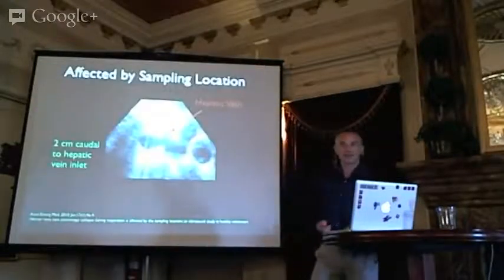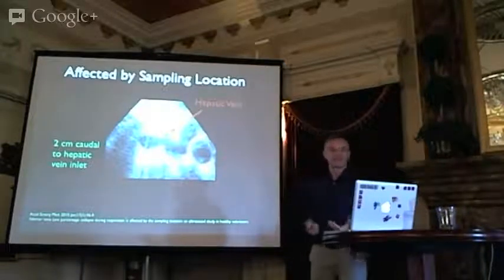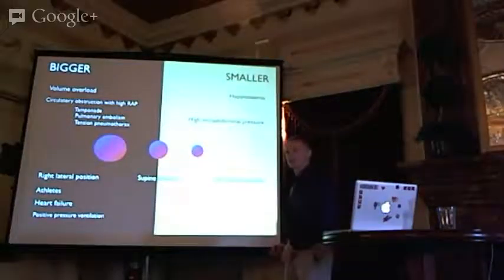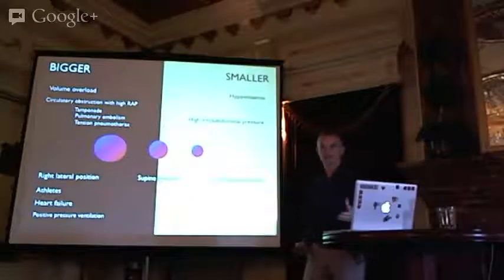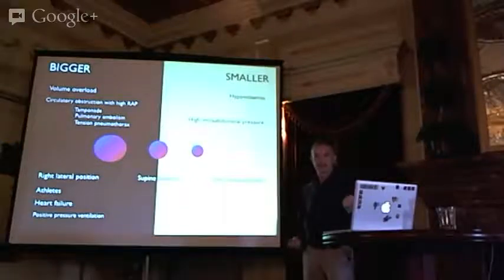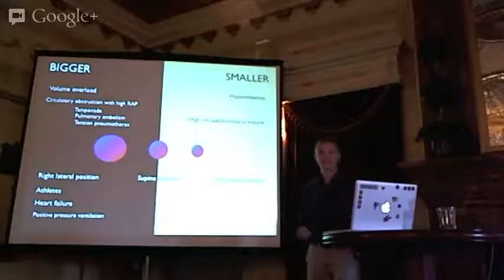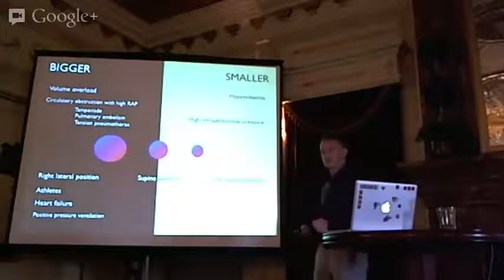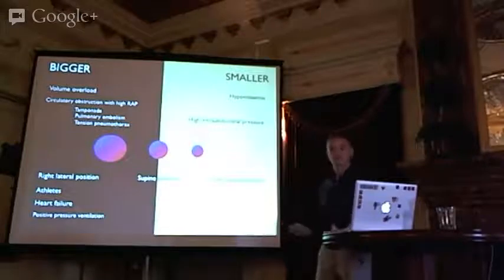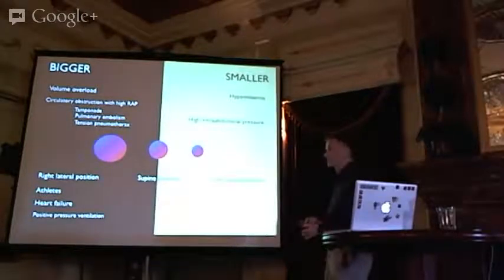Okay, so there's a whole bunch of things, as I said, that affect your IVC. Where you measure it is important, what view you're taking. Some things will make it bigger, some things will make it smaller. I was teaching basic cardiac ultrasound to doctors just last week, and we had an Italian emergency doctor who was on elective with our service, and he volunteered to be the echo subject. I thought that was great. Took his shirt off, pretty ripped, obviously very athletic, still did a lot of swimming. His IVC was enormous, but bore no relation to most of the patients we see. I doubt his CVP was 20. I'm pretty sure he didn't have obstructive shock, but he had an enormous IVC.